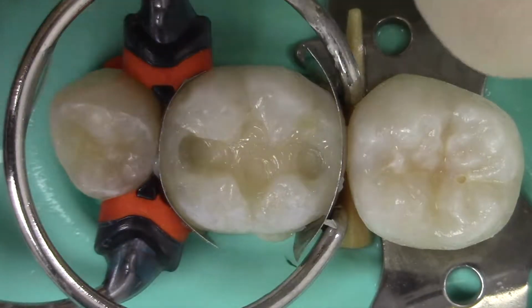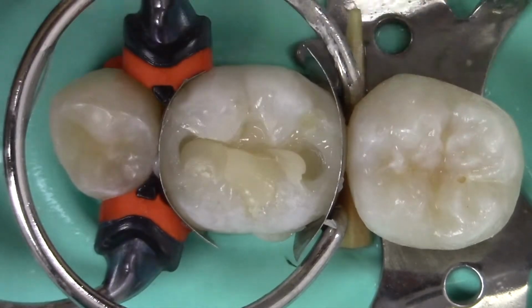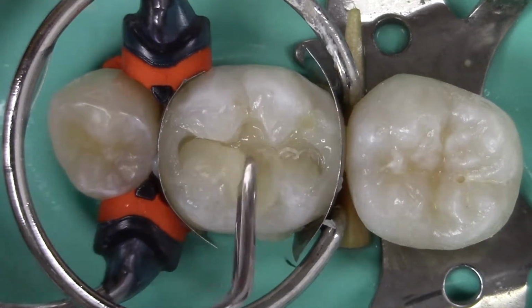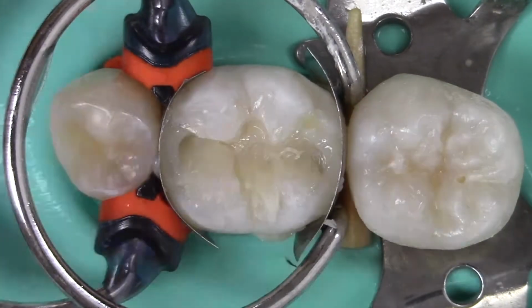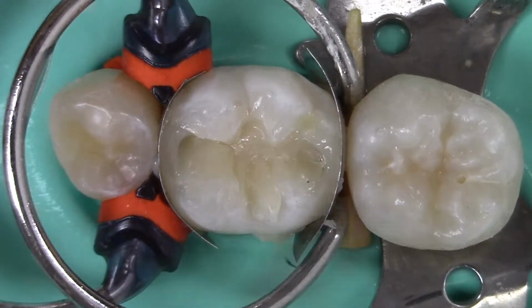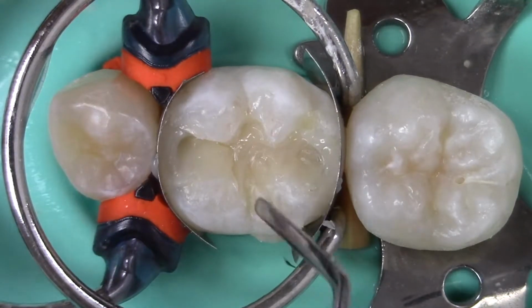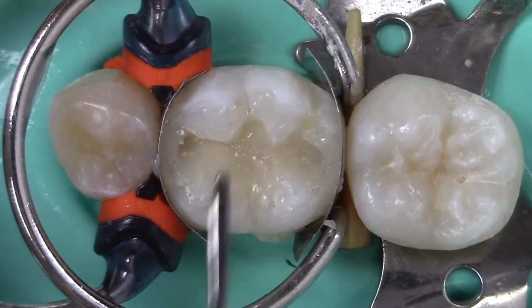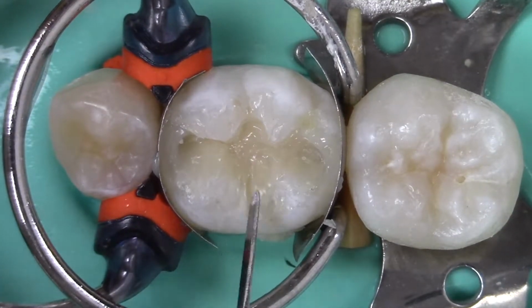The composite is then forcefully extruded against the lingual wall of the preparation. The composite is then condensed against the side of the preparation to form an oblique layer. The anatomy of the remaining tooth is followed to form the shape of the restoration. Grooves may be formed with the side of the carver.